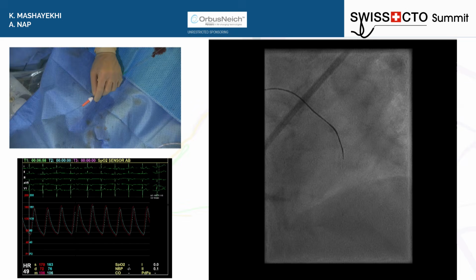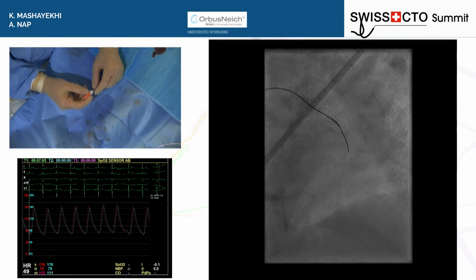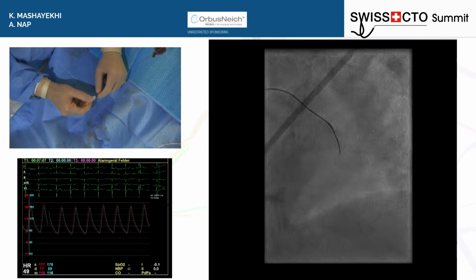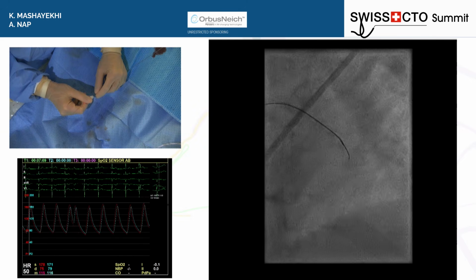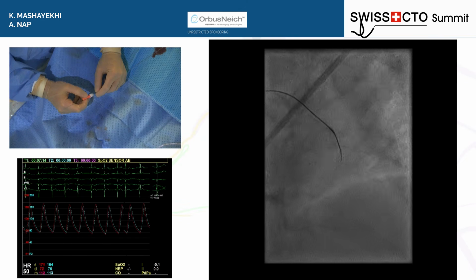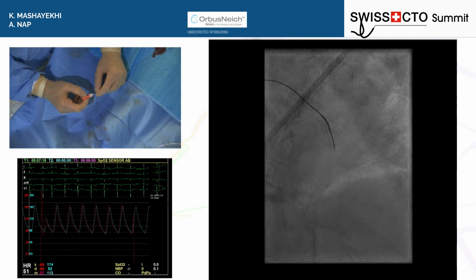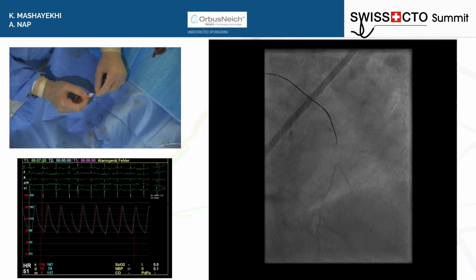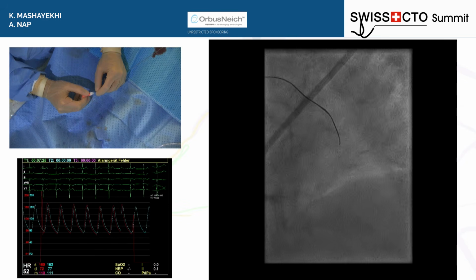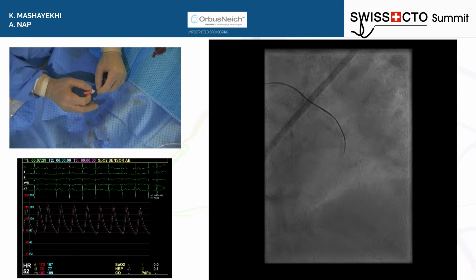And the bypass anastomosis distorts the vessel a little bit. It was shown very nicely yesterday in a talk, and so maybe the vessel course is like this and not straight, and this is all very difficult. And you're right, Hakim, as you said, post-bypass patients are an independent factor of failure. So maybe it's occluded at the point of the anastomosis, we don't know. But we're still making progress. It's following the calcium, it's in phase with the calcium, so far so good. It's very important not to buckle the wire.